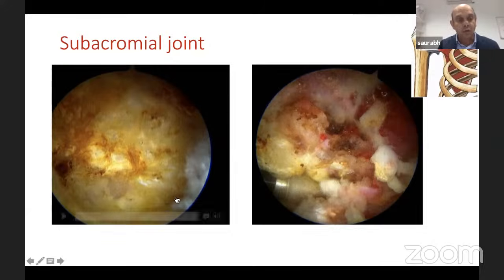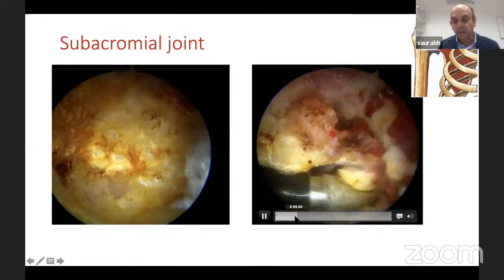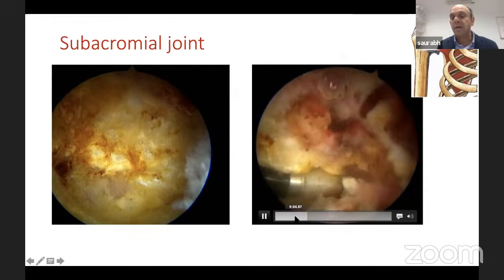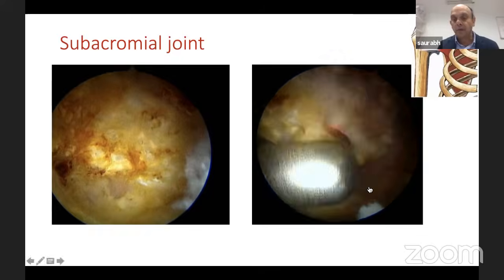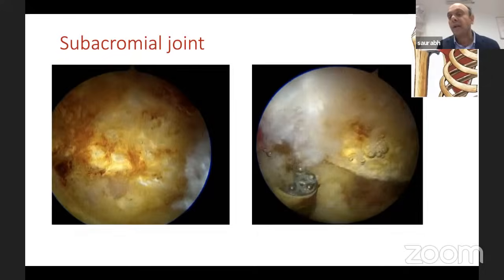So you can see acromion, this bone is starting to reveal itself. You can see it's like a gentle curved acromion. We can see in a bit more detail in this slide. So again, with the diathermy, I'm taking off all the periosteum. Another little tip here, with the diathermy, if you go too anterior, now once you're taking off acromion, and I'm on the inferior border of the acromion, deltoid is just there. So just be aware of deltoid, and you don't want to dehisce deltoid, and you don't want to cause any bleeding from deltoid. So that is important.